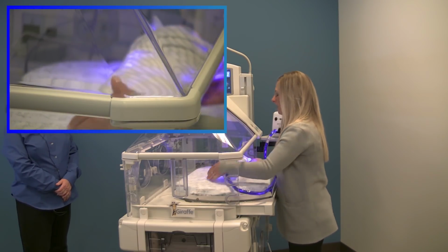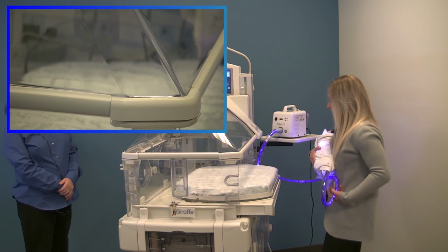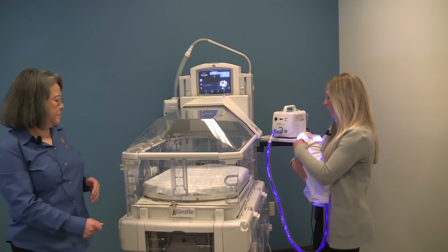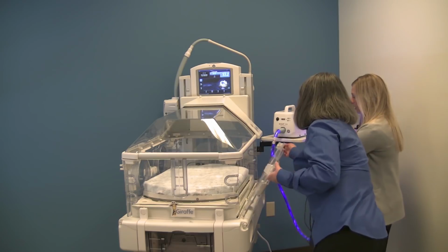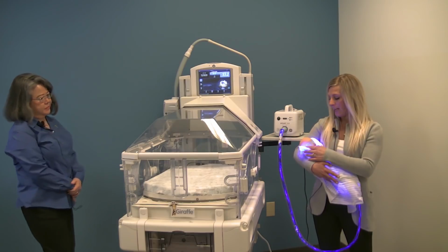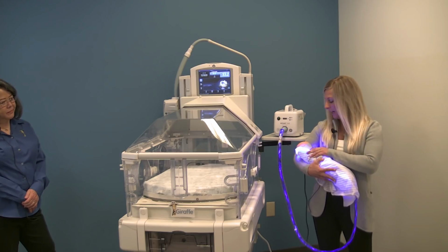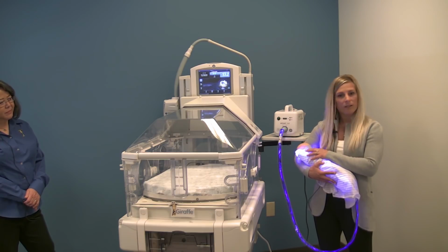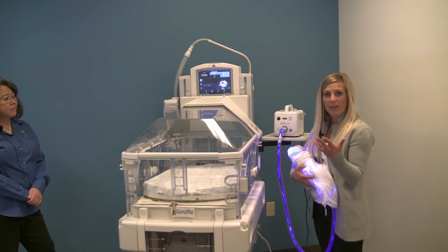And now the nice thing is if I slide baby out and bring the cable with me, I will take it out of the side grommet. I can push my base back in. And now mom can manipulate the sides of the BiliSoft pad to be able to access baby. She can just tuck that under and roll over. And now she still has access to baby's little ears, hair, cheeks, everything. So that is how you would swaddle in the BiliSoft 2.0 and then breastfeed.